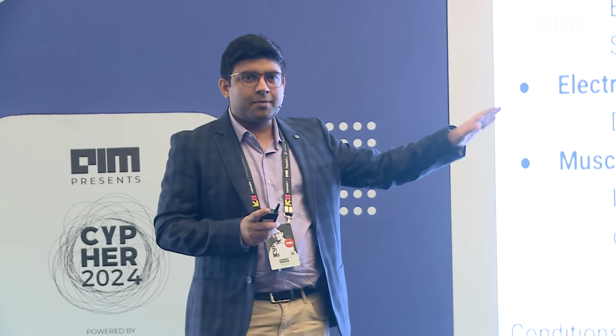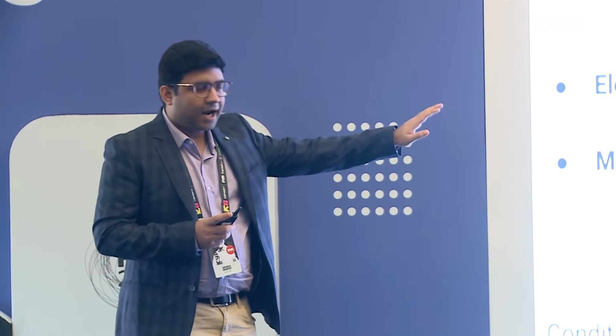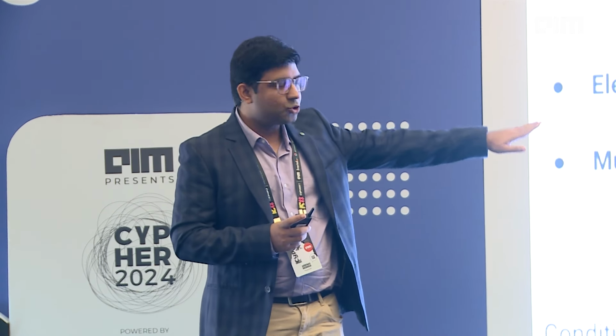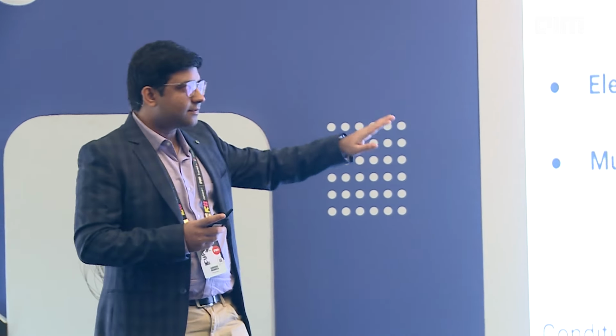An example of this condition you can see on the right-hand side. The first graph is the normal heart signal, or normal ECG. On the right-hand side is an abnormal ECG, which is ST elevated myocardial infarction. This is commonly called a heart attack. You can see the difference in the graphs. There is a small ST portion in the normal, which is not the same in the abnormal one. So this is one way to identify one type of heart attack. It's not always the ST elevated. These conditions can be as rare as 0.5% in the general population, so it's not widely prevalent, you can see.